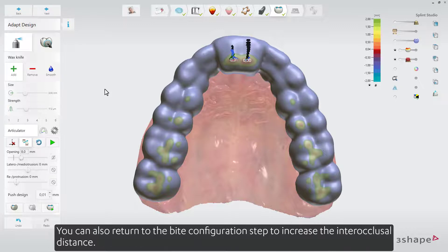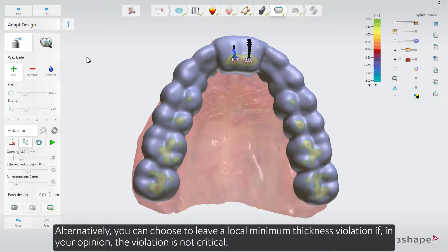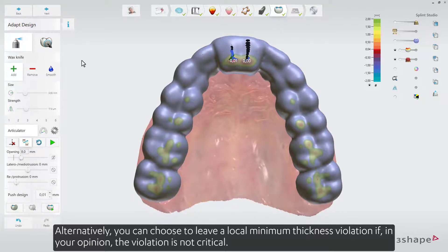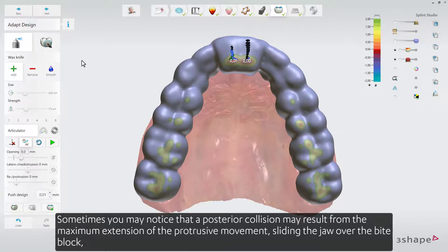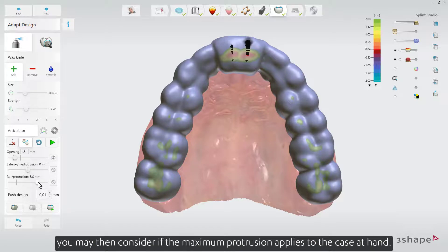You can also return to the bite configuration step to increase the interocclusal distance. Alternatively, you can choose to leave a local minimum thickness violation if, in your opinion, the violation is not critical. Note that a posterior collision may sometimes result from the maximum extension of the protrusive movement sliding the jaw over the bite block, so consider whether maximum protrusion applies to the case at hand.